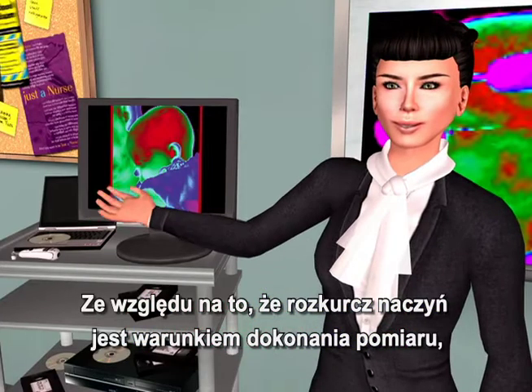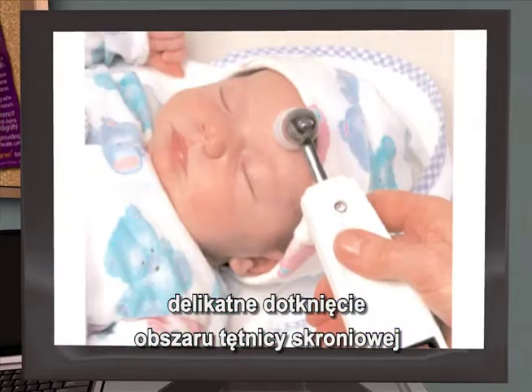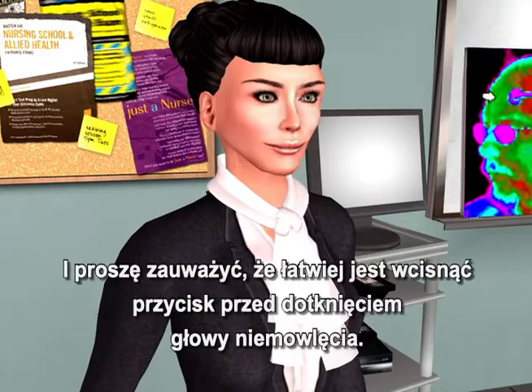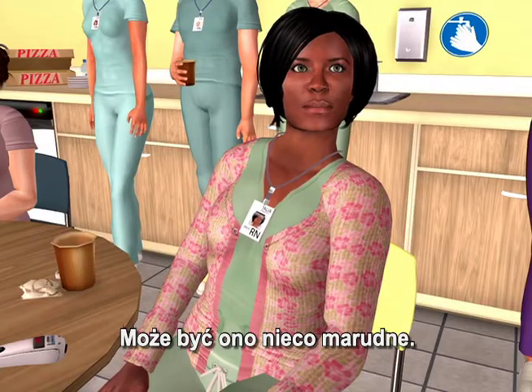As vasodilation is the prerequisite for making the measurement, a gentle touch to the temporal artery area or just a two-inch scan across the temporal artery area is all that's required for infants. Note that it's easier to depress the button before touching the infant's head — they can be a little fractious.